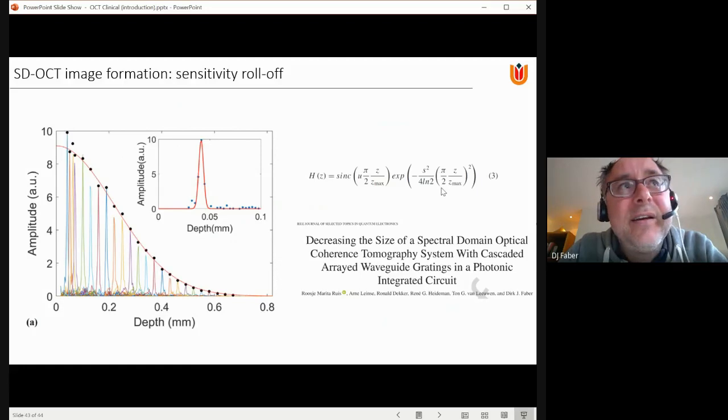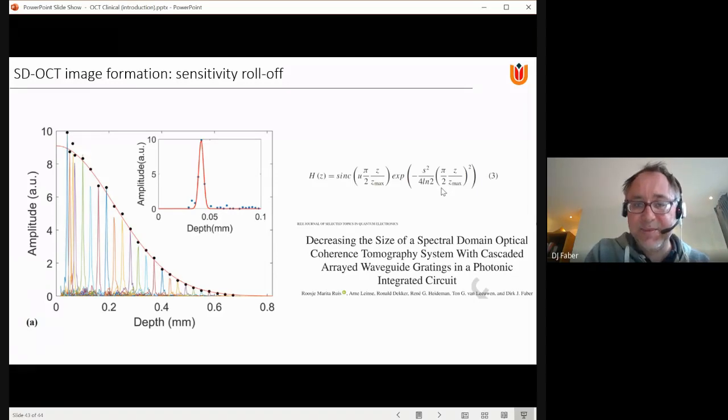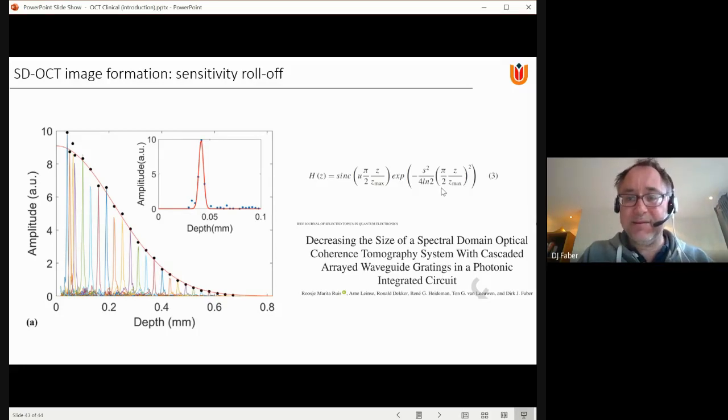as long as you can calibrate these things beforehand, then you can account for all the imaging effects that are in the system. And if you can do that, you can correct your signals, you can calibrate your signals, and you can try to estimate the optical properties from the OCT image, and from the optical properties, hopefully, the state of disease.